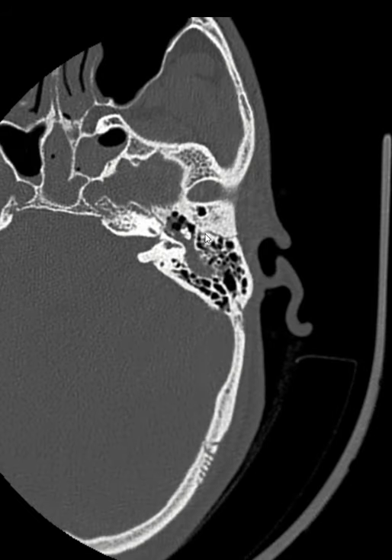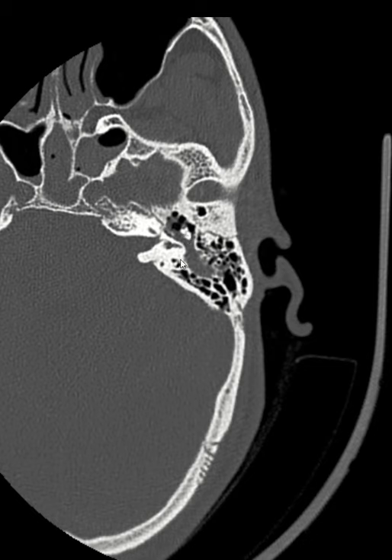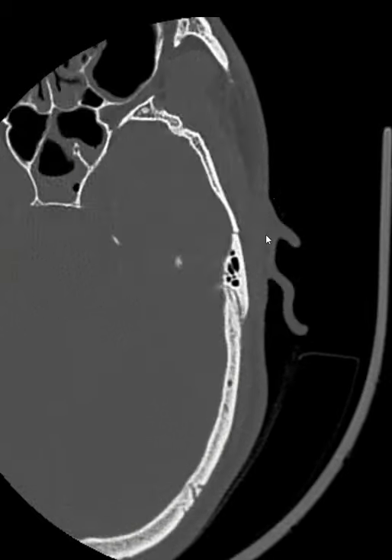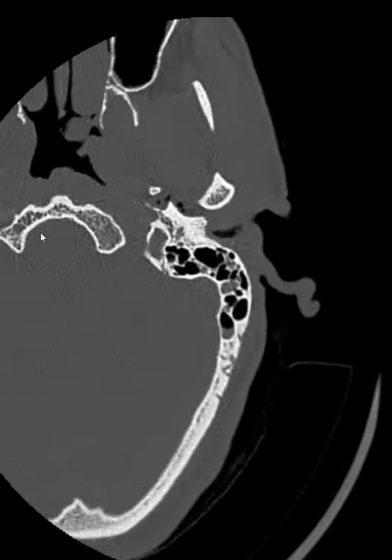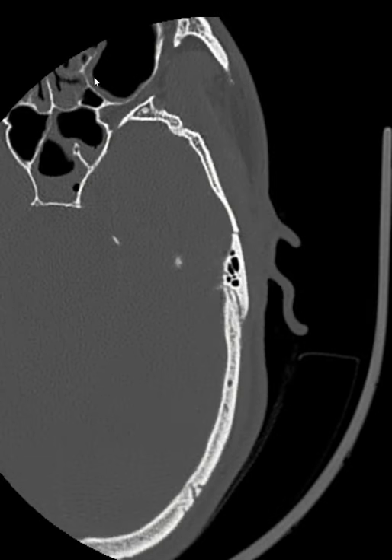This transverse fracture involving the temporal bone is noted, and you can see how well it is delineated, involving the middle ear. Possibly there is a fracture involving the medial side as well, and there is a hemotympanum here in the middle ear. You can also see the sphenoid sinus involvement.